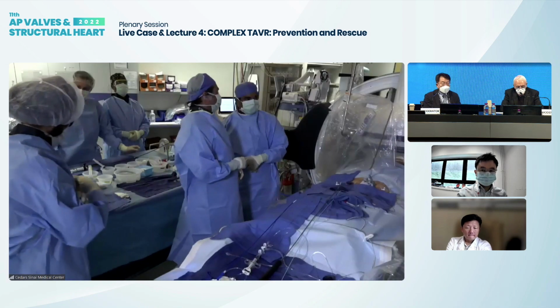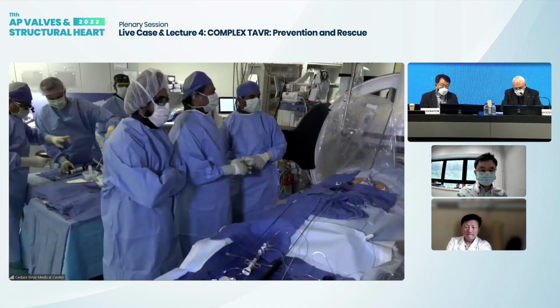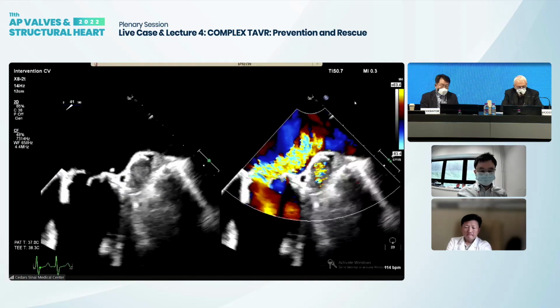All right, so let's see, either Sid or Moody can give us a little tour of the valve. Tell us what you actually saw on imaging.